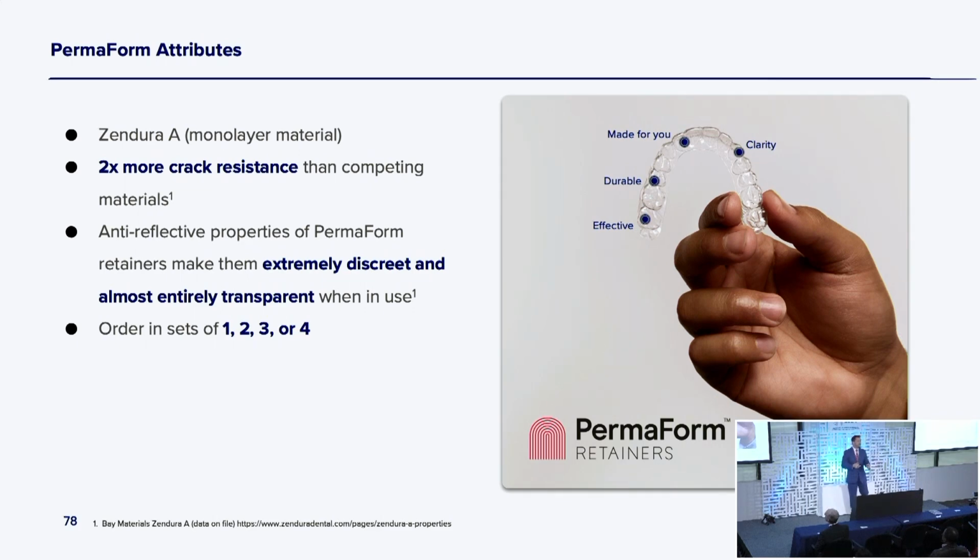It's a Zendura A. Our aligners are Zendura Flex, so they're built for 2-week intervals to move the teeth, and if you have to wear it a 3rd or 4th, you're fine. But the retention should be stronger. You do want more rigid in your retainer because you'd like to wear it every night for extended periods of time. The Zendura A is a little more rigid.